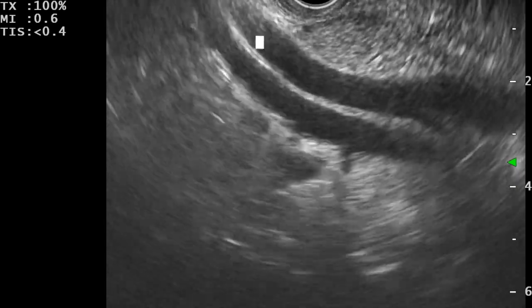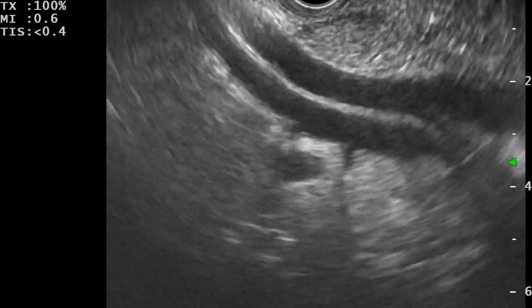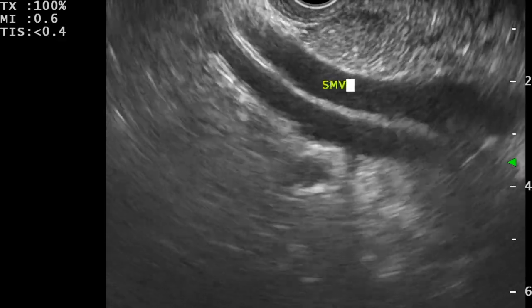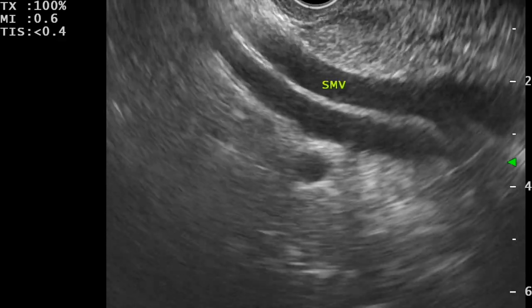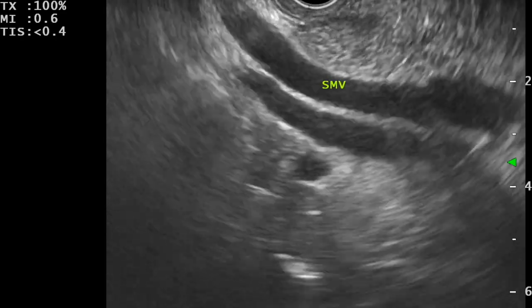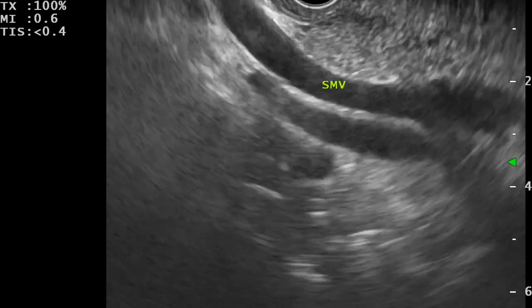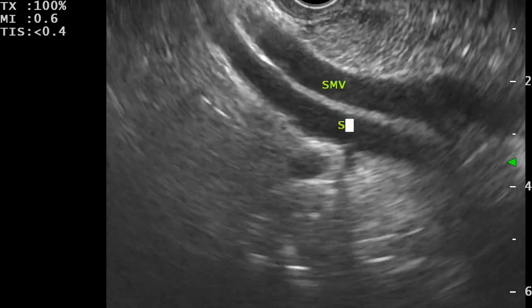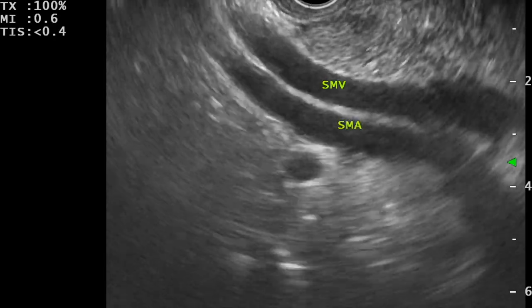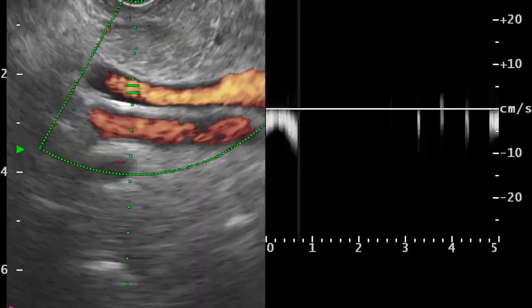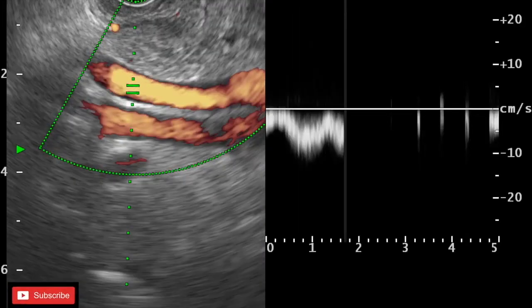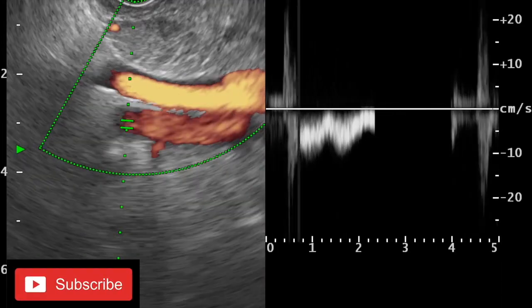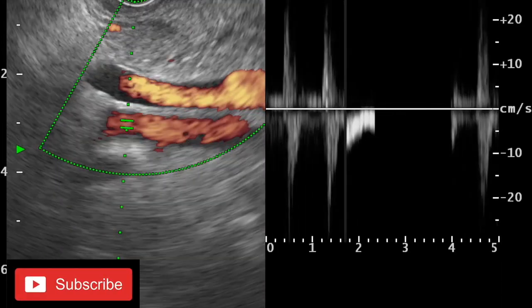With a clockwise torque from this position, we can see two vessels. The upper vessel is the SMV and the vessel below is the superior mesenteric artery. Once we apply Doppler, we can confirm that the upper vessel has venous flow and the lower vessel has arterial blood flow.